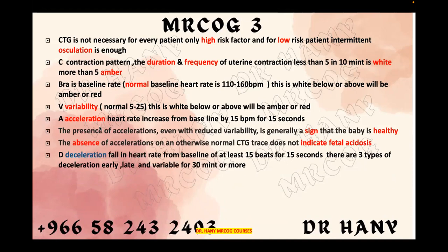Deceleration, and you said fall of 15 beats per minute, over 15 seconds. And there are 3 types: early, late, and variable. The early, which is mirroring the contraction. The late, which comes after the contraction. And variable, which is a V shape.